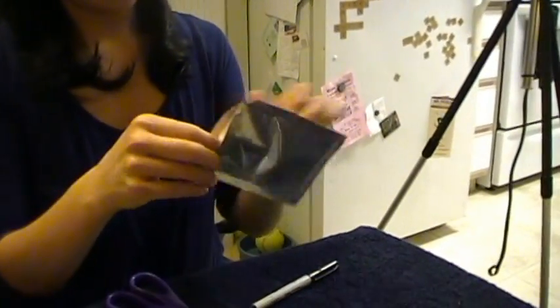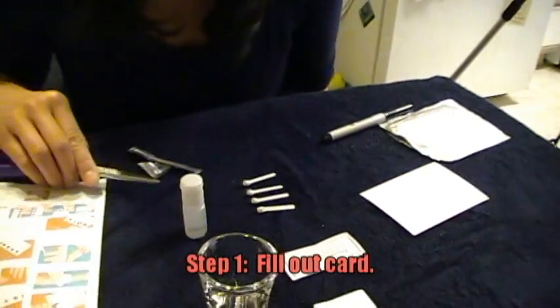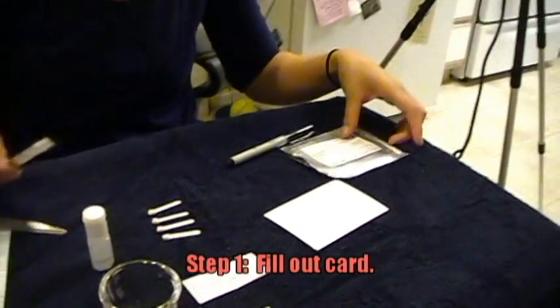We're going to do a blood typing test using the Eldon card kit. Remove the Eldon card. Step one is to fill in the data of the person being tested. I am testing Mr. Stevens.